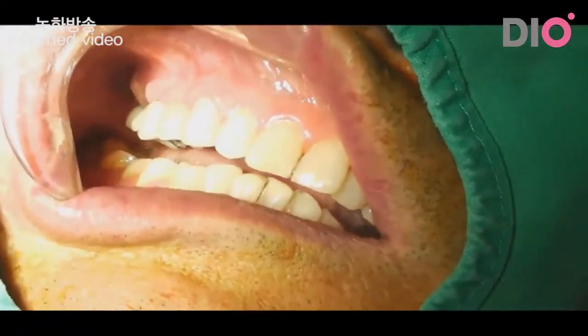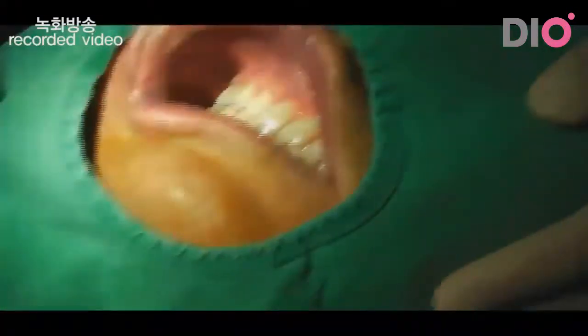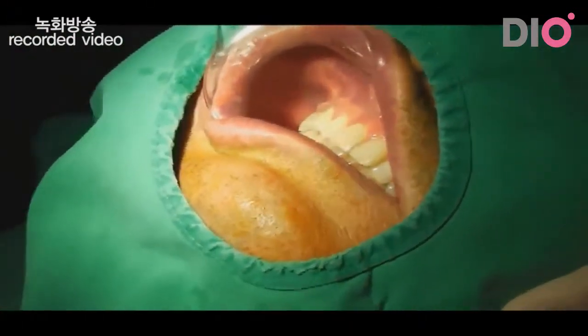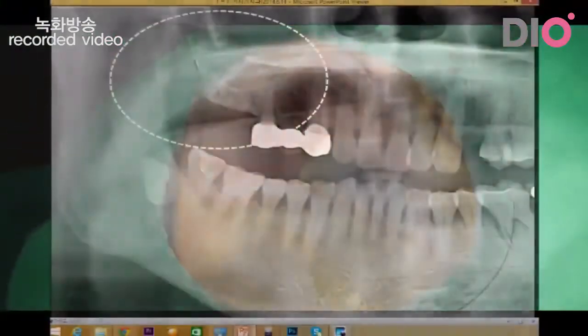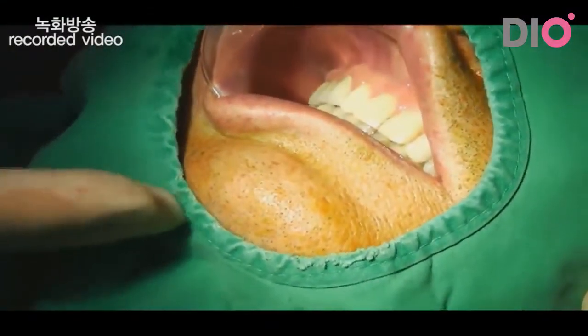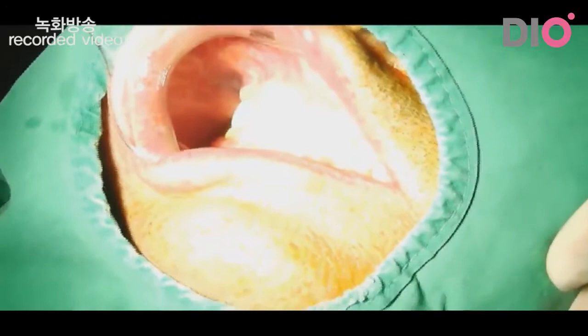Okay, this is the final result. You can see no bleeding. There are no sutures. You can see the perfect occlusion of the immediate restoration.